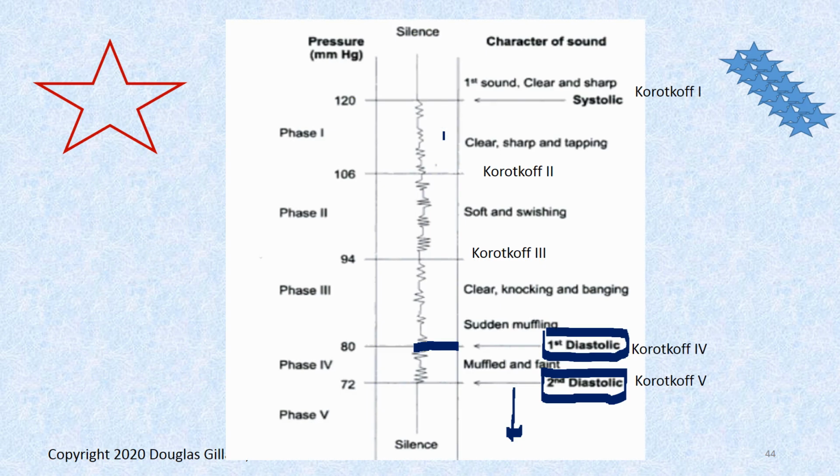Let's go back through to this picture. So you're coming down, and in an auscultatory gap, you have this silent period. You hear a boom, boom, boom, and all of a sudden it goes silent again, maybe through Korotkoff 1 and Korotkoff 2. This is the silent period, and then it comes back. Then you can hear another Korotkoff sound.